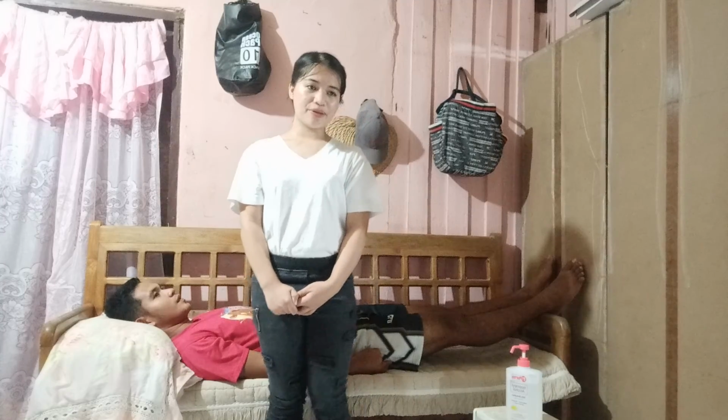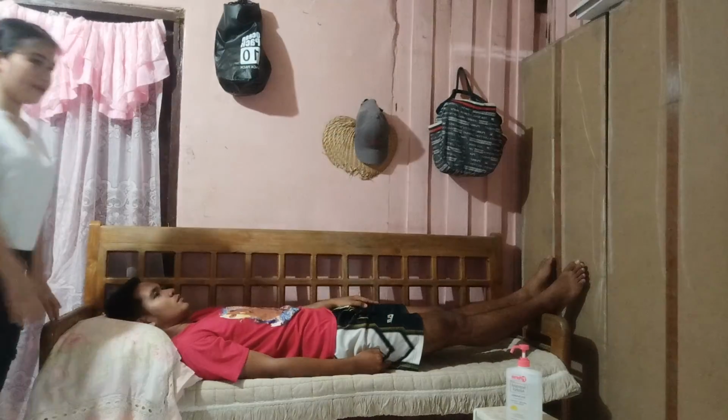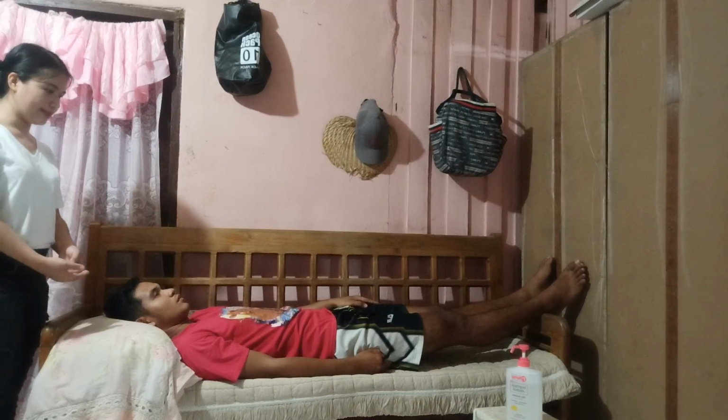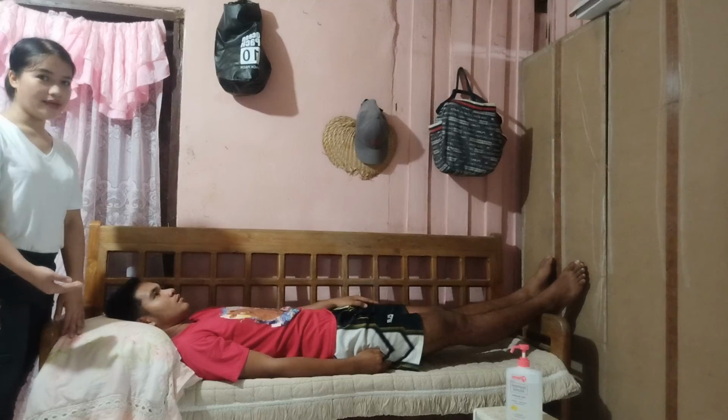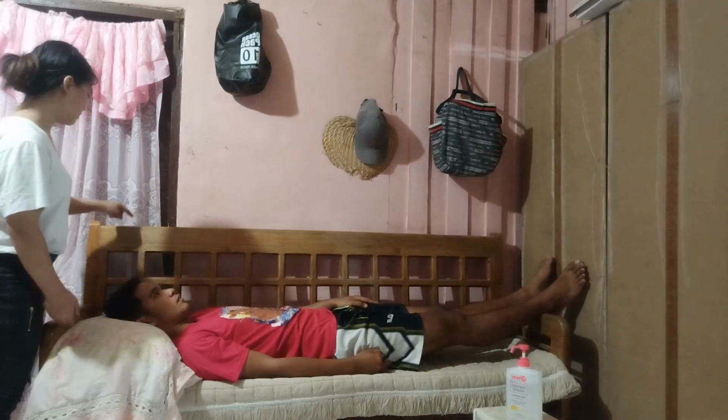The next step is to raise the bed to a height appropriate for personal safety. This is done to ensure the patient's comfort and allows the nurse to assist the patient properly. So, assuming that there is a button here to raise the bed, I will be raising the bed now.